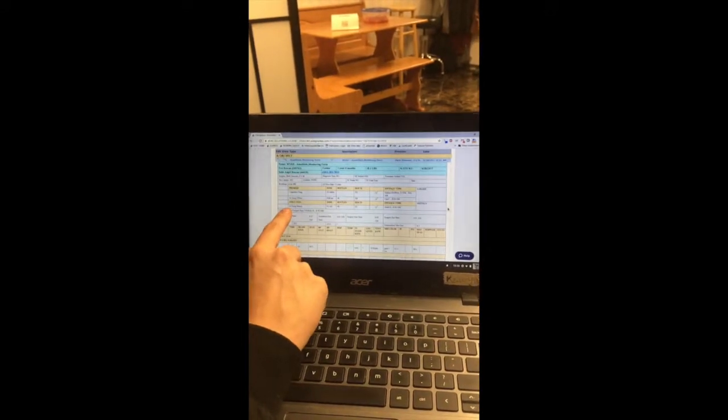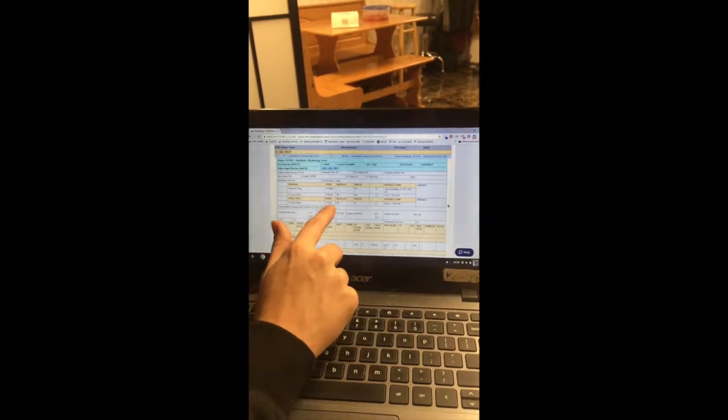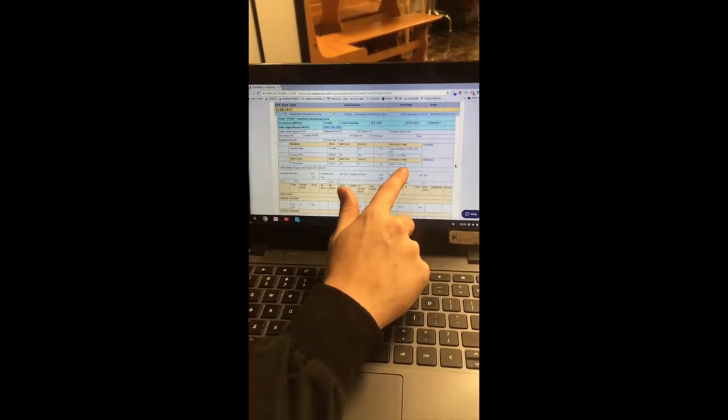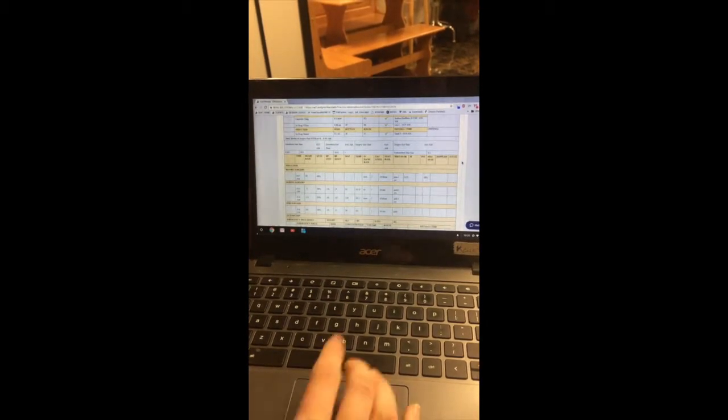We also have our induction drugs. We use Tilazol for induction, the amount that we're going to give, the bottle number again to log it, the route that we're going to be giving it through, and that it's marked off with who gave it. We checked that the surgery pack was sterile. Her surgery was performed earlier today, so we have a full monitoring form here.